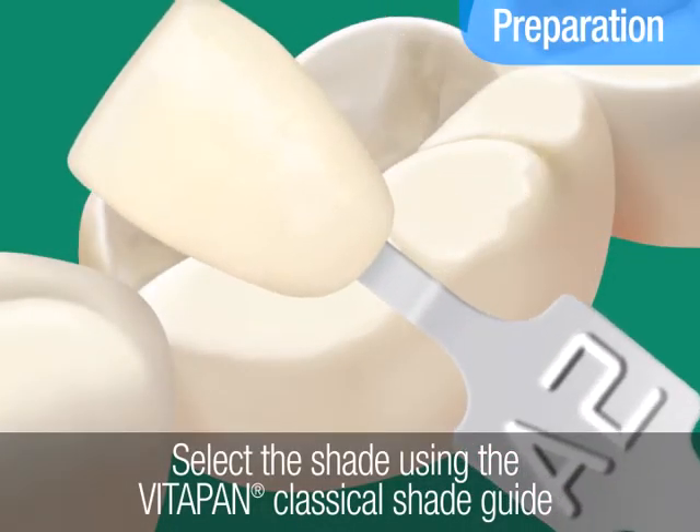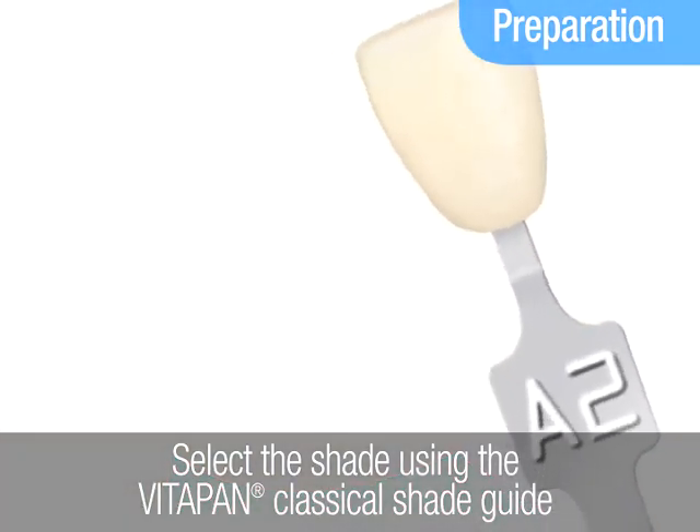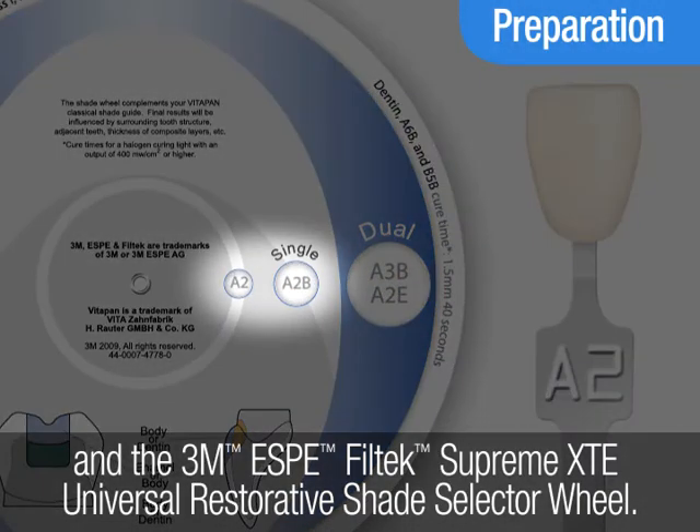Prepare for the procedure by first determining the patient's tooth shade using the VitaPan Classical Shade Guide. Then select the corresponding body shade of Filtec Supreme XTE Restorative.